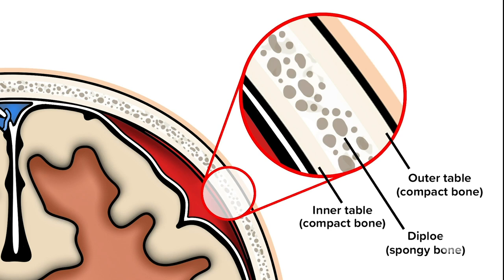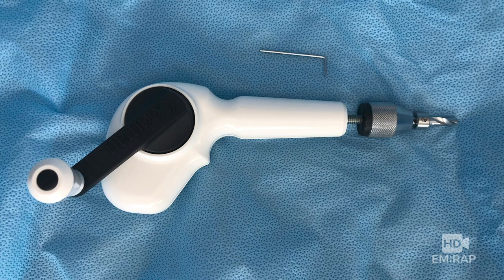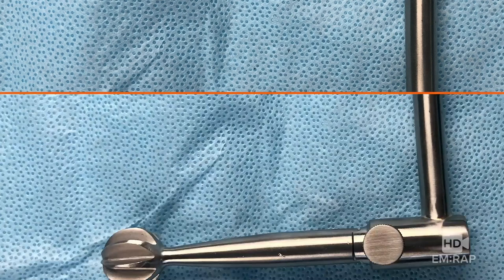Now take a deep breath because we're ready to trephinate. You may have an electrical drill or a manual drill like the one shown here, which actually has a hand crank. This one also has a stopper that you can set to a maximum depth. So if you have a CT scan, measure the depth to get through the inner table of the skull and set the stopper accordingly. This video demonstrates the Hudson Brace — we first attach the perforator bit. Once you get through the outer table of the skull, you switch to the conical burr.